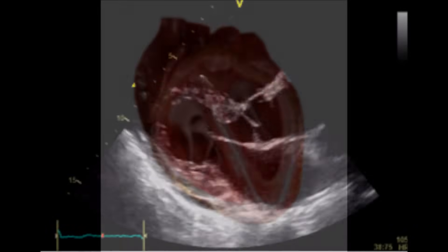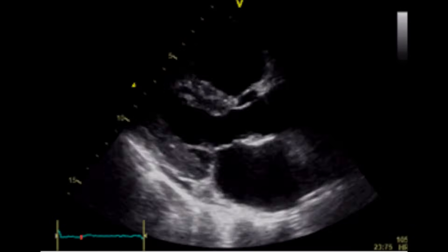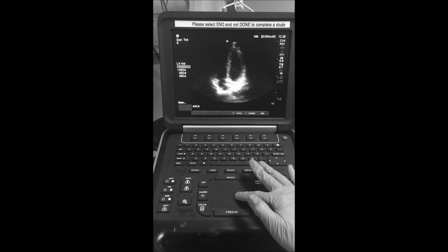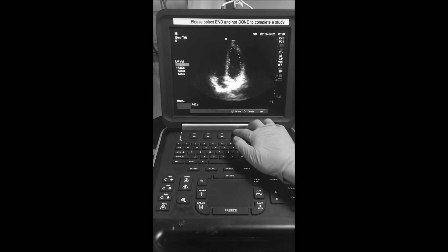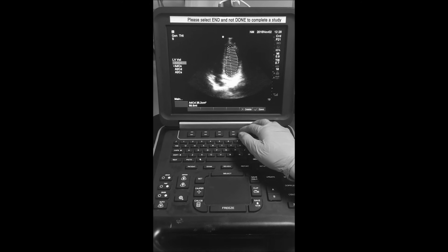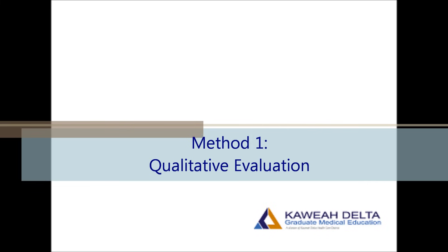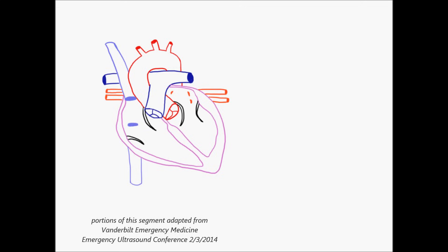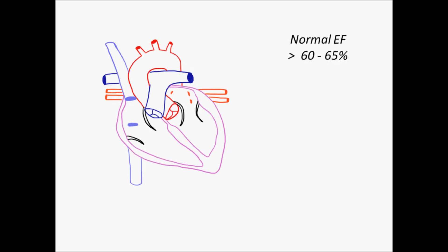Another drawback is that because the measurements taken are based on the operator's observations, some degree of inaccuracy can be expected. We can improve this with repetition, practice, and improving our skill set. There's also going to be some degree of inter-operator variability in the measurements. By visually inspecting the heart in echocardiography, we can roughly estimate whether or not the ejection fraction is normal — this being greater than 60 to 65 percent — and accuracy improves with repetition as we become more proficient in obtaining the views.